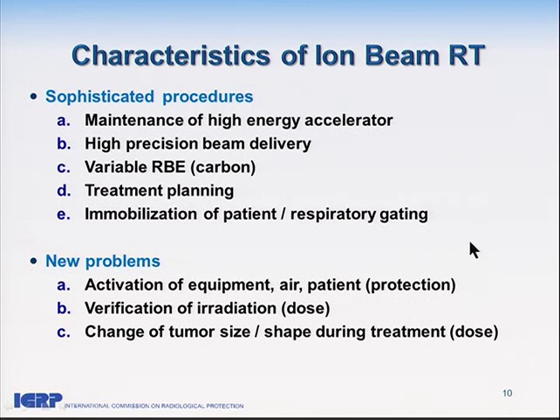We also see new problems with this technique. This is activation of equipment, as I said. Air and the patient are also activated slightly. Therefore, we need protection. And verification of irradiation is another issue, and I'll tell you a little bit later.